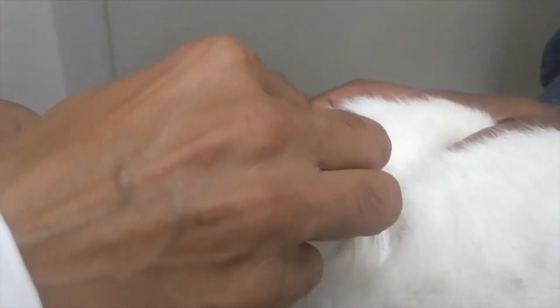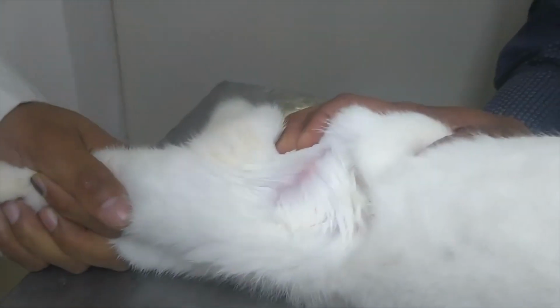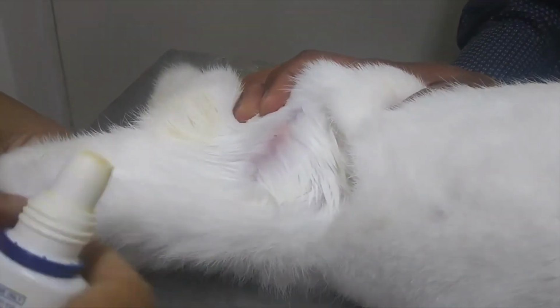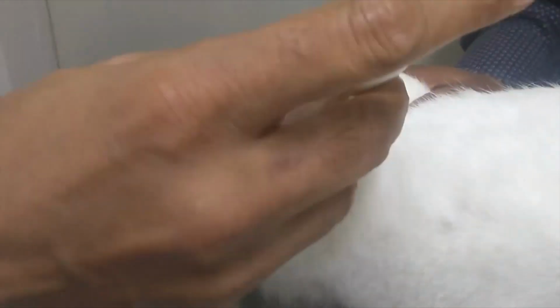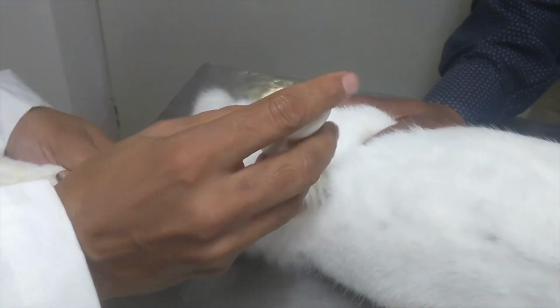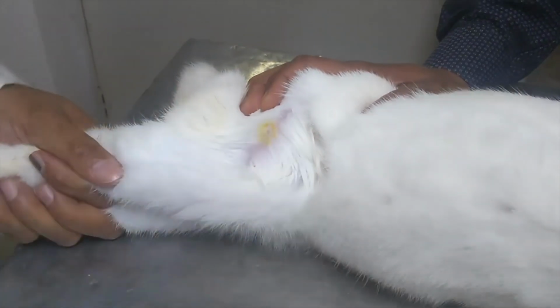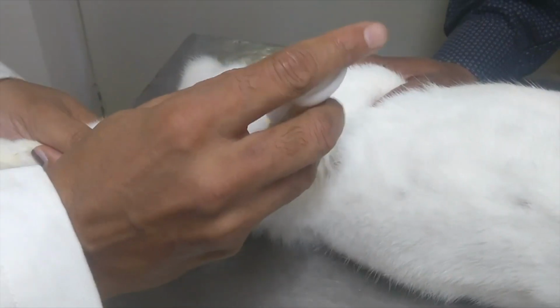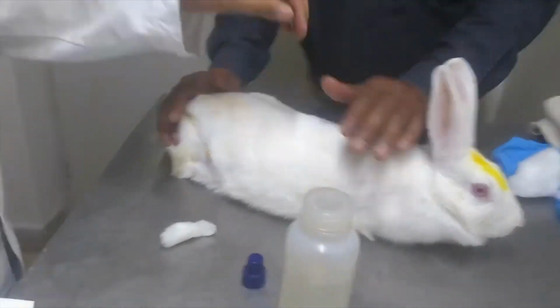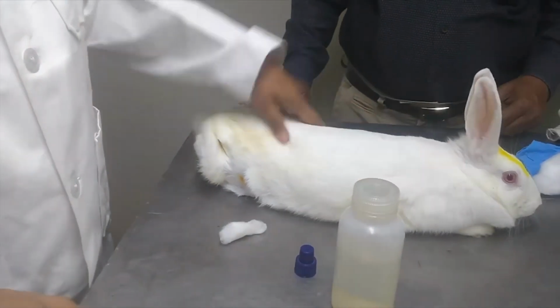We have taken it out, clean the area again, and then we apply some antiseptic powder. Here it is betadine powder, so that infection cannot develop later on. We sprinkle some of it at the area of injection. And then slowly release, leave the animal relaxed, and it is immunized.